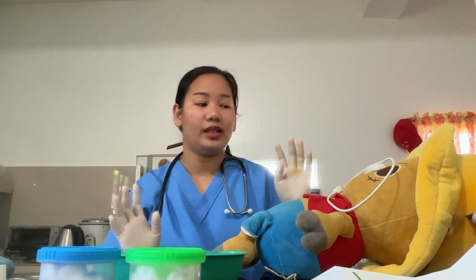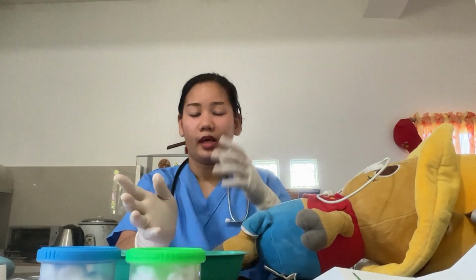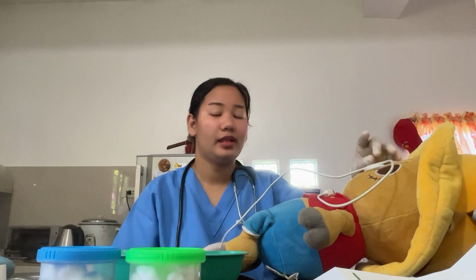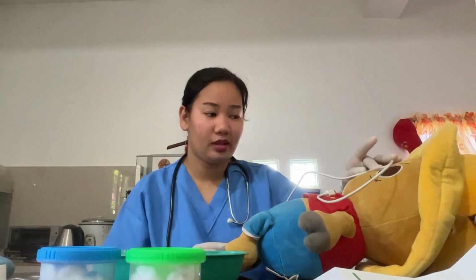Okay, then after that, I will remove my gloves and the gown that we used, and then perform hand hygiene. Okay, now we are going to clean this nostril and this tube. I am going to clean this nostril, this tube, and document today's date and the time of insertion.